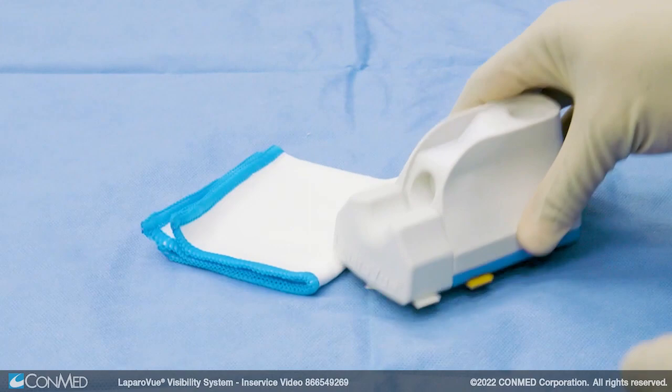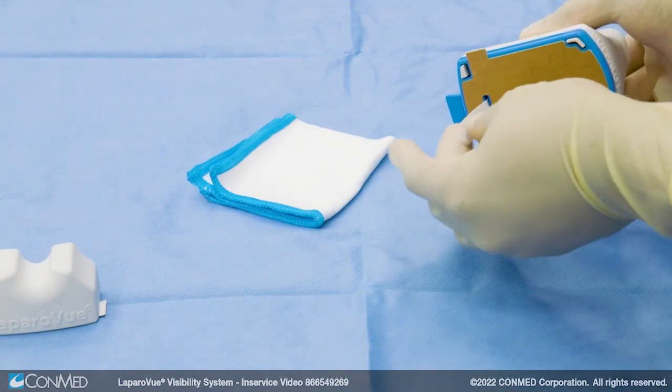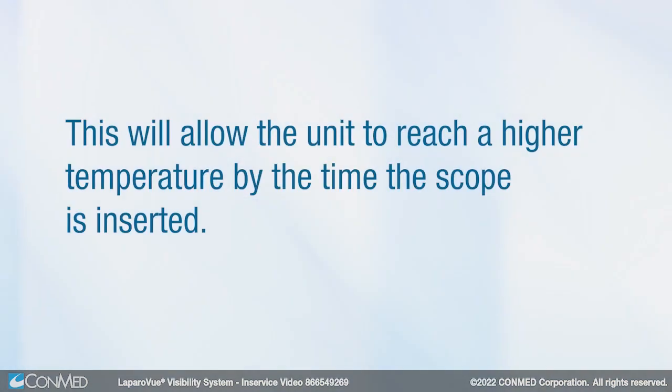To set up the Laparovue unit, separate the scope cradle from the main unit, then pull the pull tab on the bottom of the unit. For use in a laparoscopic case, pull the pull tab while the room is being set up. This will allow the unit to reach a higher temperature by the time the scope is inserted.